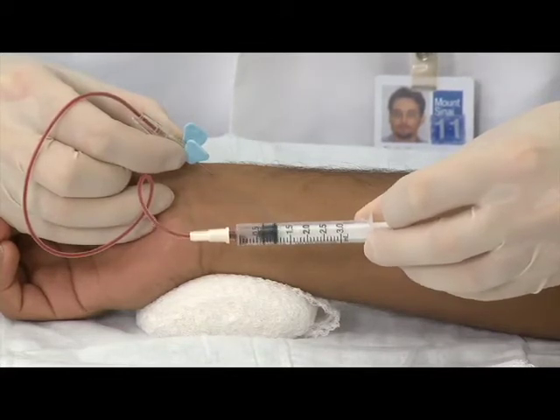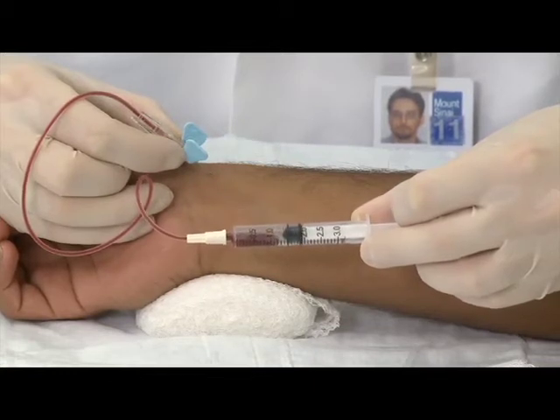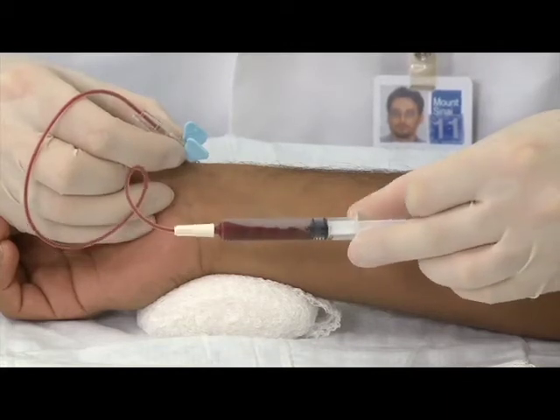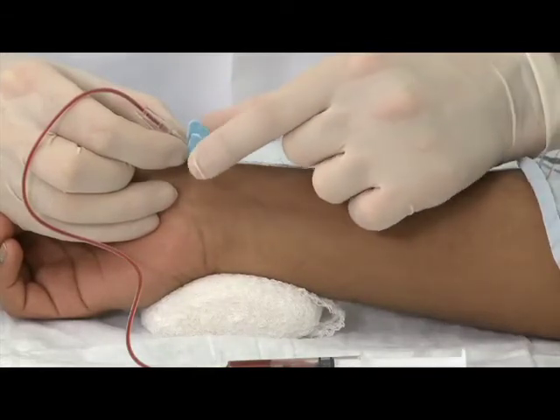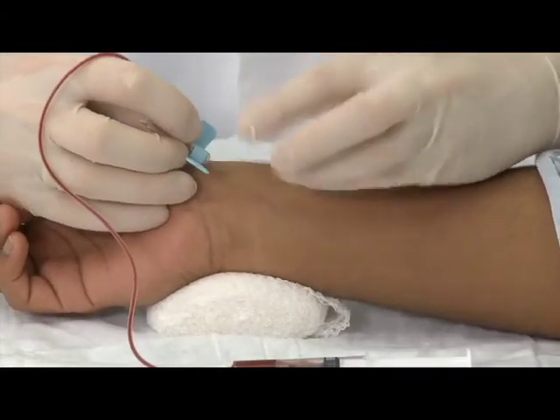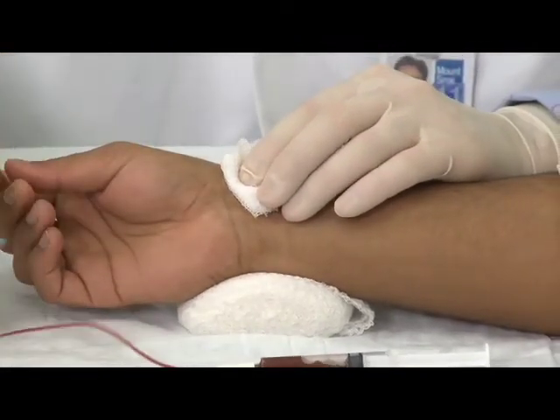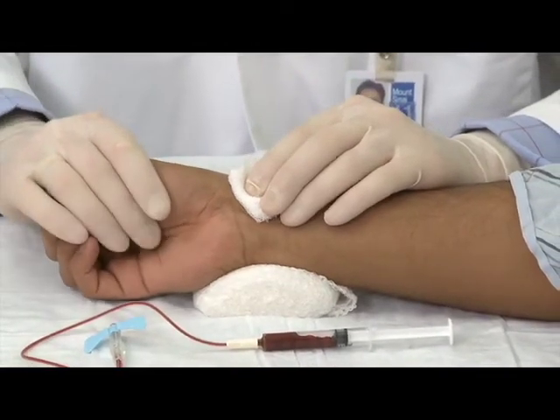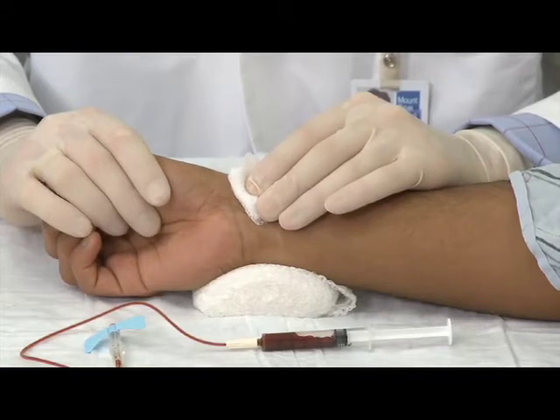Manual pulling of the plunger is not usually necessary to fill the syringe directly attached to the puncture needle. It may be needed with the butterfly tubing system. Withdraw the needle when the desired amount of blood is present in the syringe, generally 1 to 3 cc's. Remember that very small amounts of blood can be below the requirements of the analytic equipment and can cause direct measurement errors due to disproportionate heparin admixture.